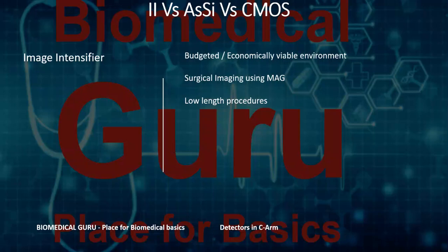And now we'll just consider where to buy or when to buy an image intensifier, or a machine with amorphous silicon detector, or a machine with CMOS detector. Image intensifiers, as we know, is an existing technology for quite some time. That's why it is more economical. So if you want to go for an economical system, or if you want to use the machine principally for surgical environment where you need to use more of mag mode, then image intensifier is a better technology for you.